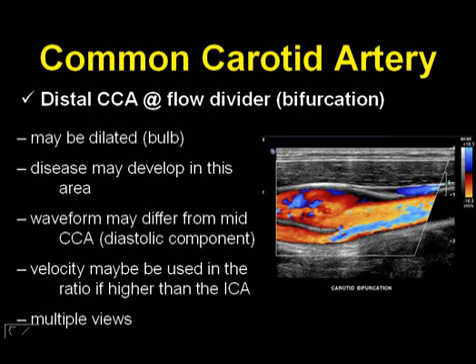And I know some people may call this the bulb, but keep in mind that the bulb could have involved any portion of the common carotid artery system, including the internal and the external carotid arteries, or it may not involve any portion of the carotid system at all.